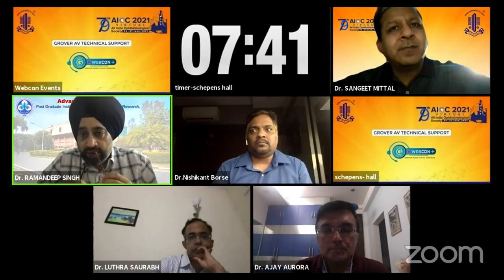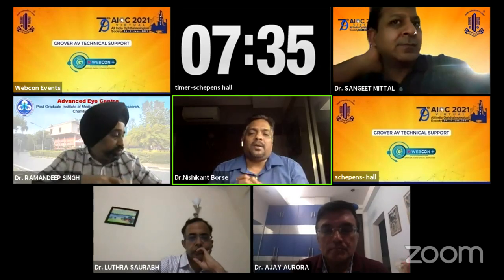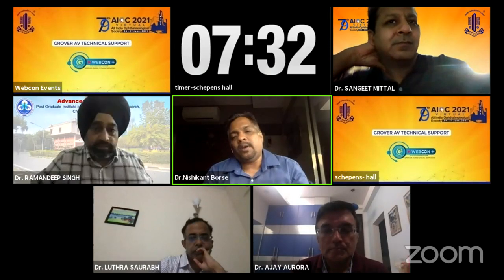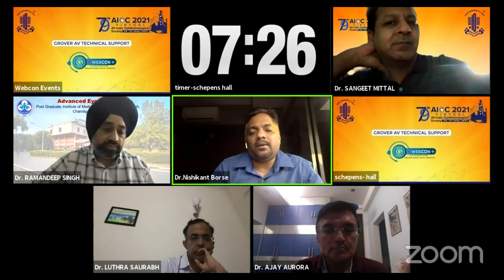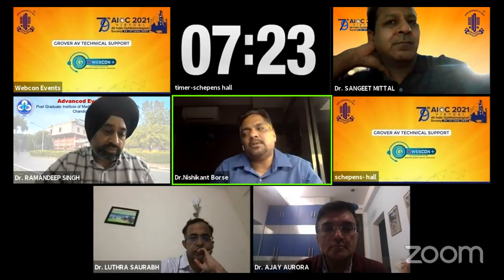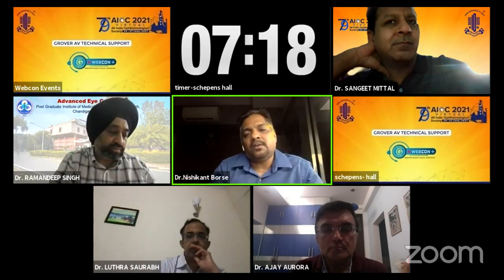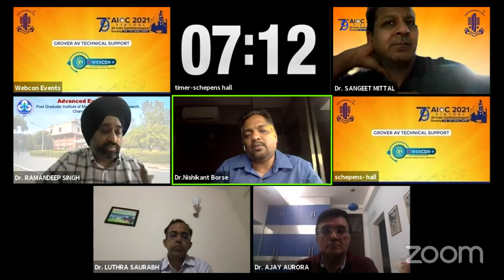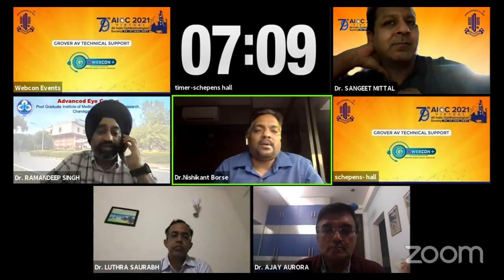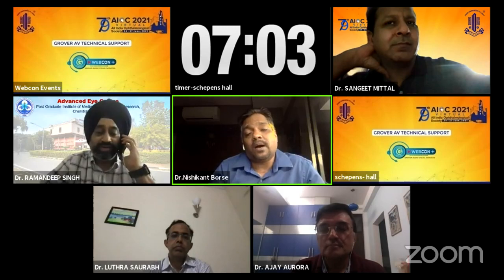No, the point is, Ramandeep, if you have a very large or a massive bleed, just injecting a small TPA and waiting for it to displace on its own, it's not going to happen. So you have to actually go ahead and remove it. Now, what happens is with a very large hemorrhage, how much TPA can you inject? It becomes difficult. So technically you can inject TPA on day one and wait for 12 hours and then go inside and try to remove it from a small retinotomy. Maybe, but otherwise, especially if you know that there's a CNVM scar underneath, you can go ahead and do a retinotomy, remove the blood and the scar.